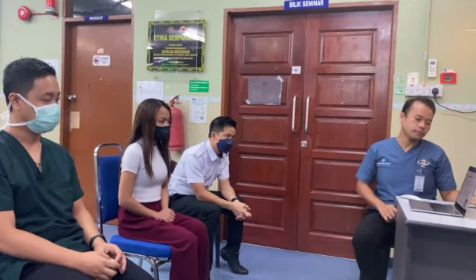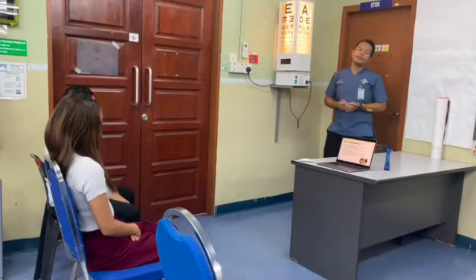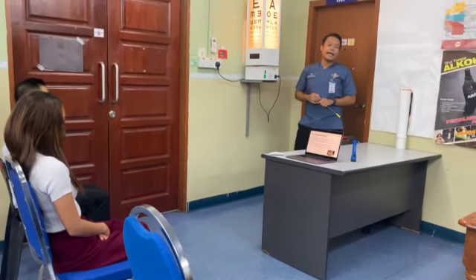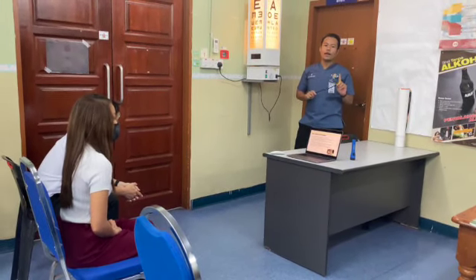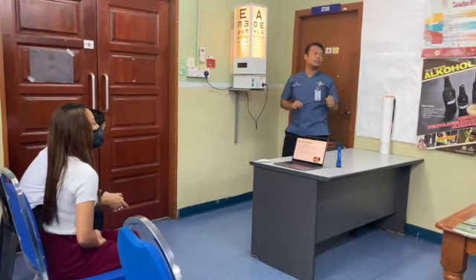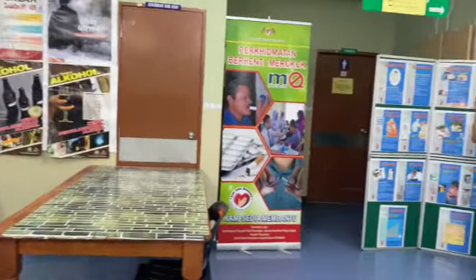I need one volunteer to help me perform this visual acuity test. First, we need to adjust the distance. The starting point should be 6 meters from the Snellen chart, and then we are going to test either with pinhole or without pinhole. The patient should be tested with the right or left eye first, either left or right.